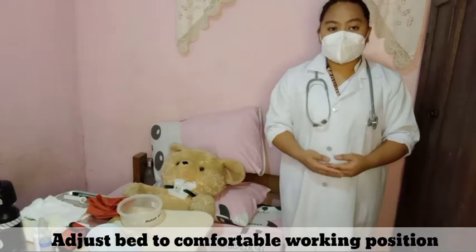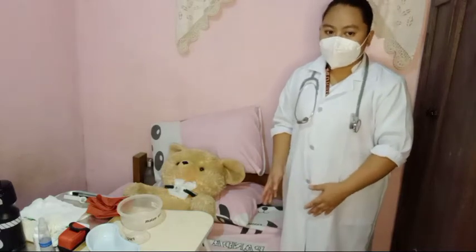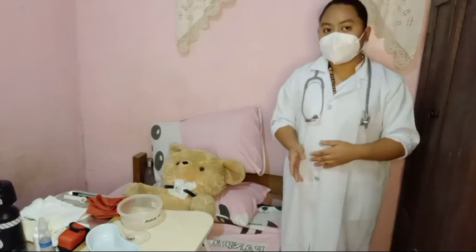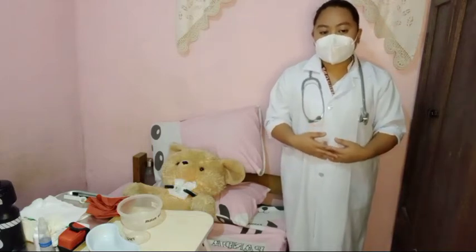Adjust the bed to a comfortable working position, usually elbow height of the caregiver. Lower the side rail closest to you. If the patient is conscious, place her in semi-Fowler's position. If the patient is unconscious, place her in lateral position facing you. Move the overbed table close to your work area and raise it to waist height if possible.